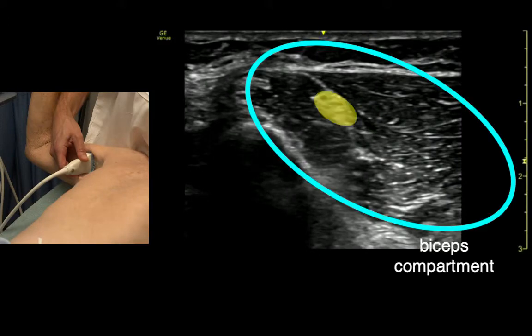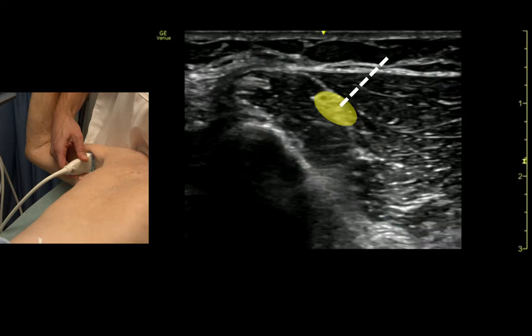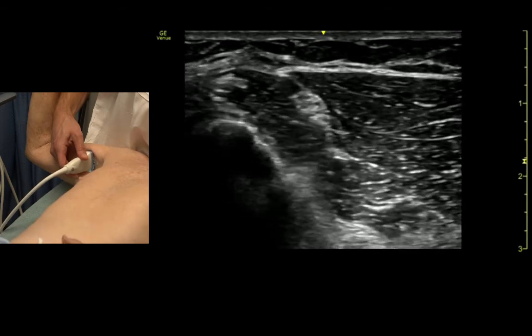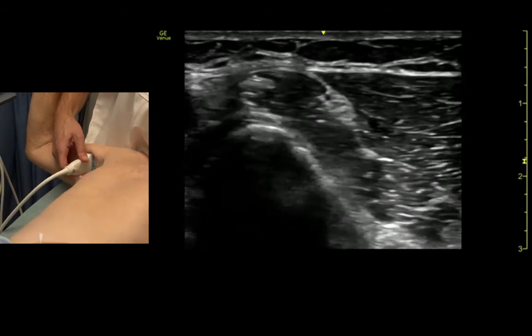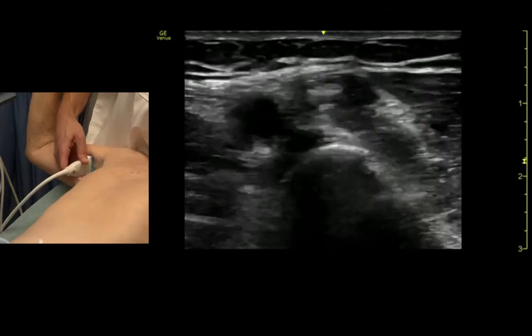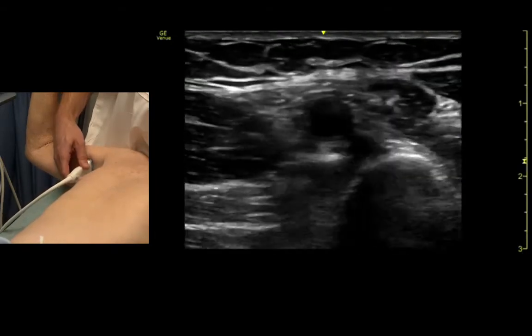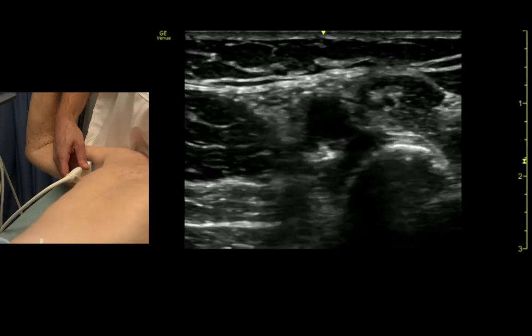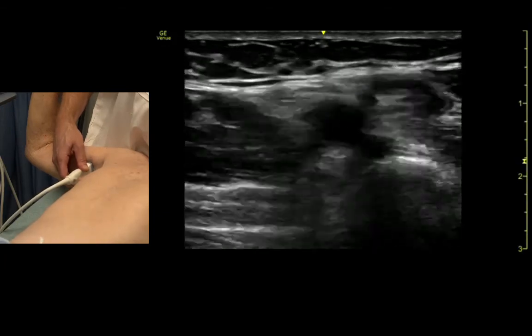If we want to numb the entire forearm, we've got to inject that as well. The rest of the nerve tissue just wraps around the artery, so the artery is your main target if you're trying to do an axillary nerve block.